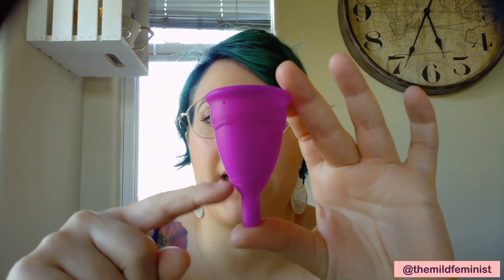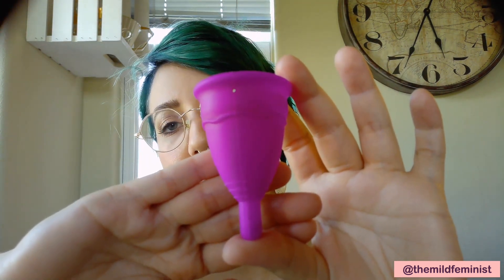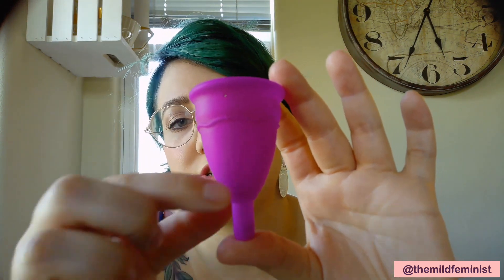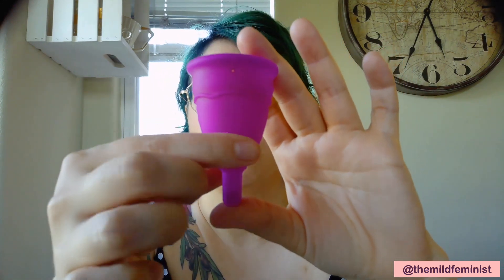Okay, so moving on to the base. This is the base down here — you can see it's got like lines on it. This is generally where you would grab the cup when you're pulling it out. So that's really the most important part of the cup, in my opinion — the base. Just know that it's this part of the cup, not the stem, not the bulk of the cup — this part right here. That's the base.